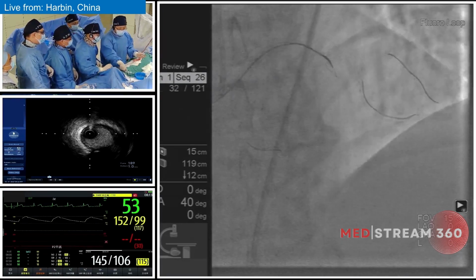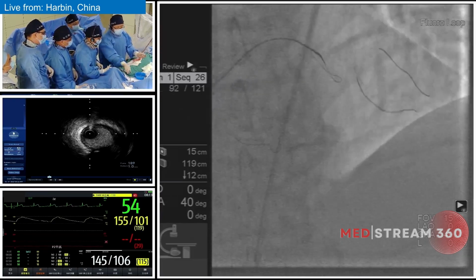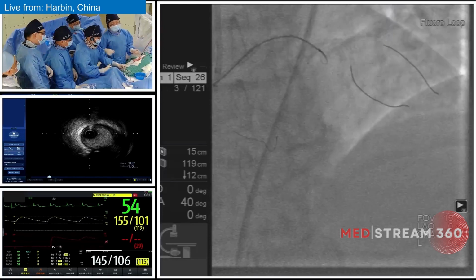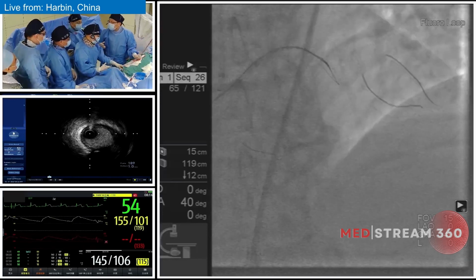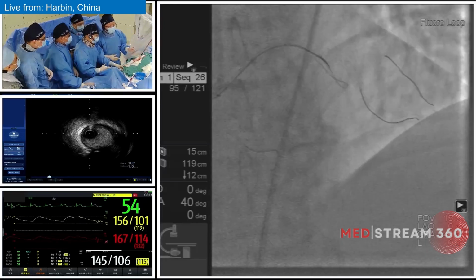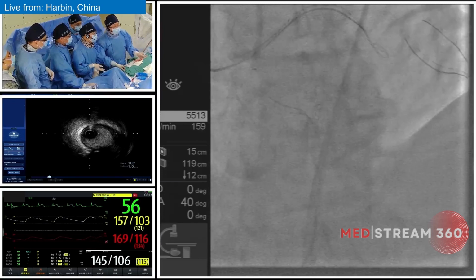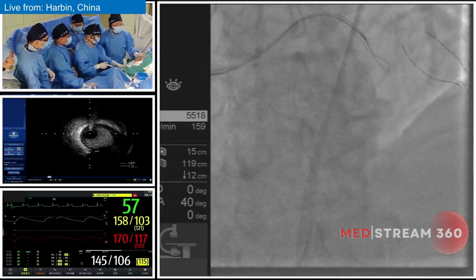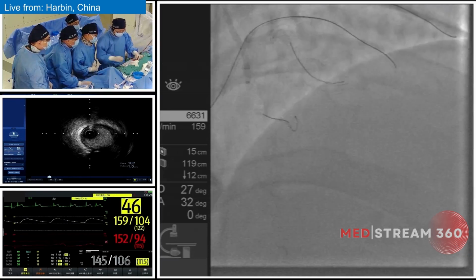I think we're already in the knuckle. Yes. So the antegrade contrast injection should be avoided. Yes. So we should use a contralateral angio, to avoid the potential antegrade dissection and hematoma, which means that from now on, the angiography from the antegrade should be avoided. Professor Lee is working on the ADR techniques.